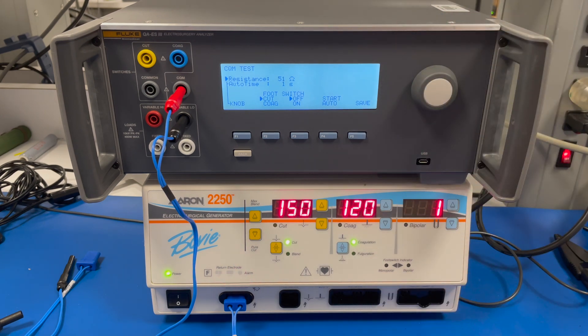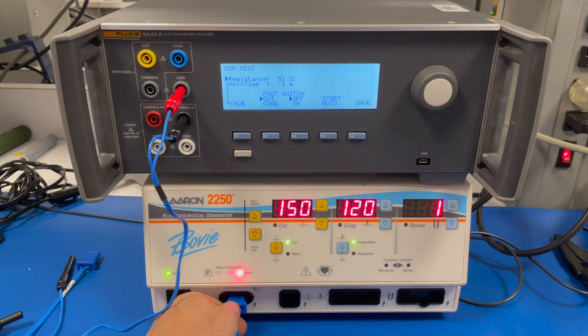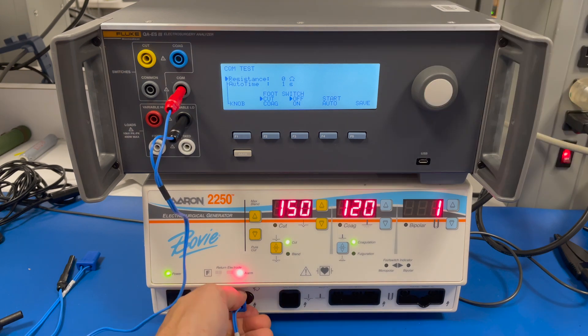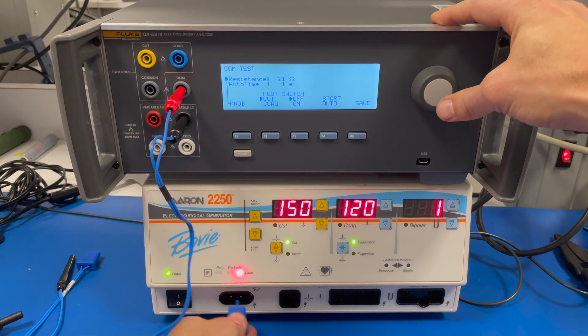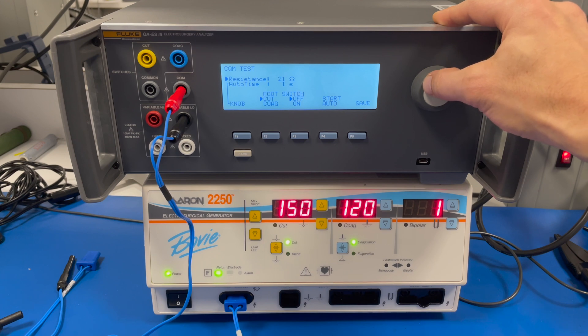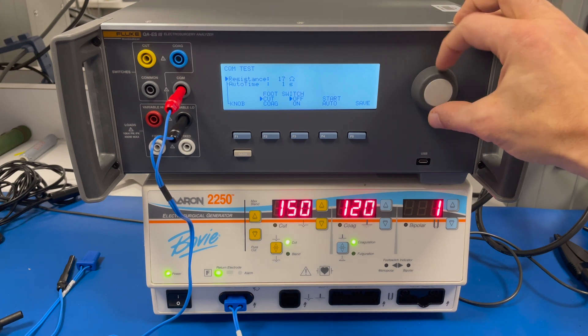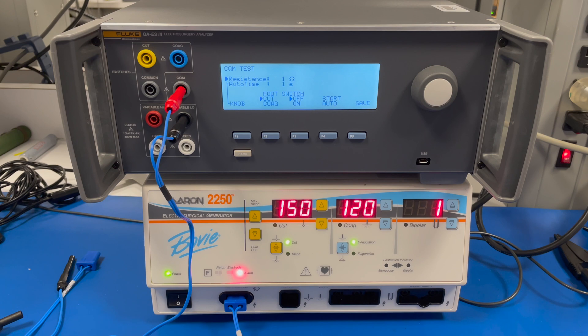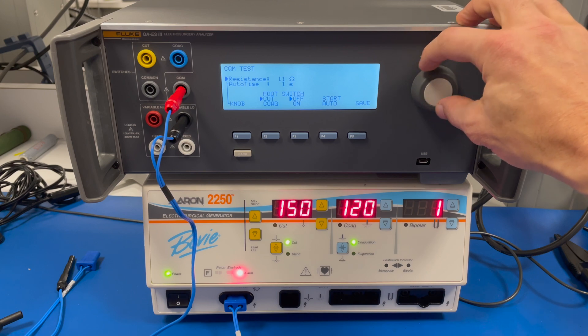Every time you increase the resistance, you throw the circuit, so one way to reset it is to unplug it. First we're going to check the low limit — basically all this is is a fancy decade box; you could actually use a decade box instead of this tester. I'm going to scroll down slowly until the alarm goes off at around one ohm. That is the low limit. Ideally, for this particular generator, the low limit would be between five and nine ohms, so it's a little off.